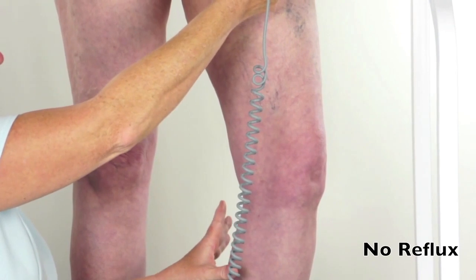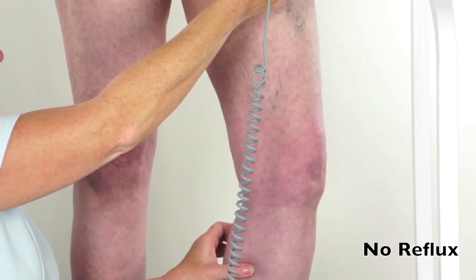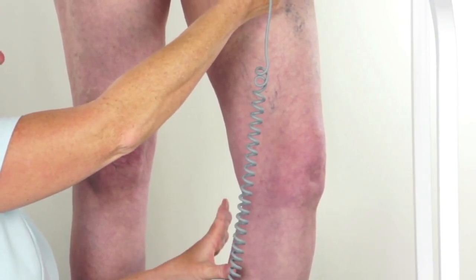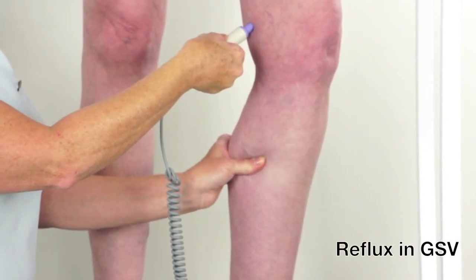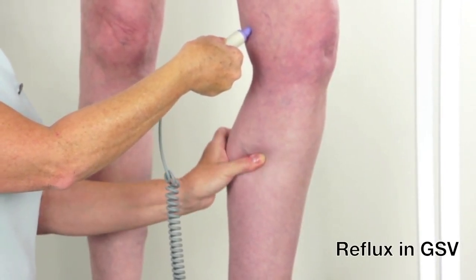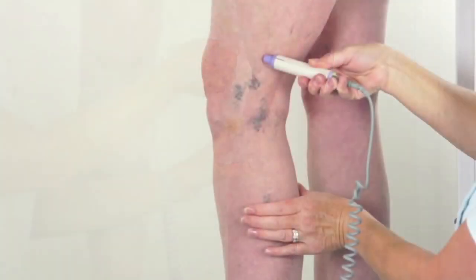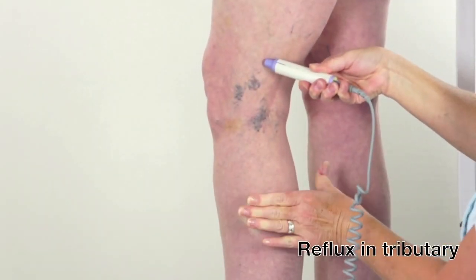When the calf is squeezed, an augmentation signal is heard indicating forward flow up the vein towards the heart. When the calf is released, any reflux is detected by another auditory signal.